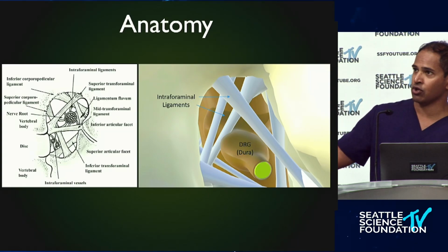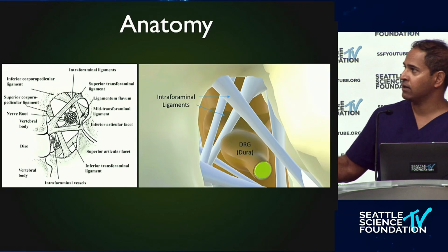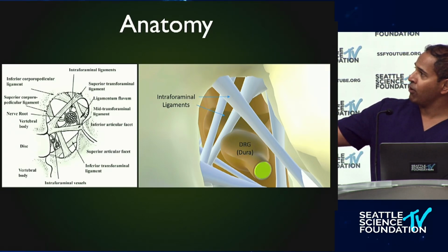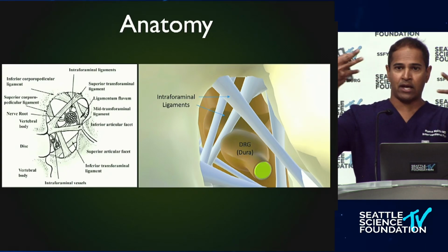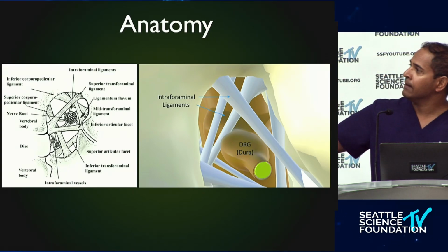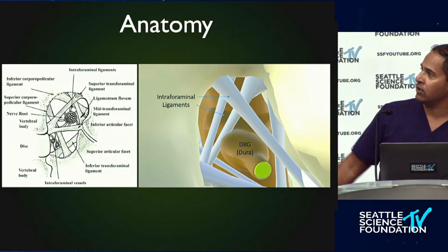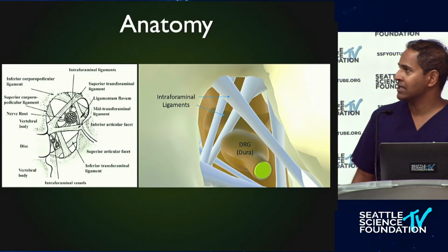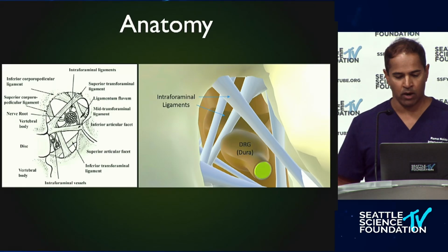As Dr. Mehta will show you, when you pop out with the sheath, you'll feel this release. And that's actually really stimulating, because as you try to poke out with the sheath, it's going to stretch sort of the strings of a tennis racket and create tension on the DRG and nerve root. That can lead to some paresthesia, and in some situations, dysesthesia. And we'll talk about how we walk through that.